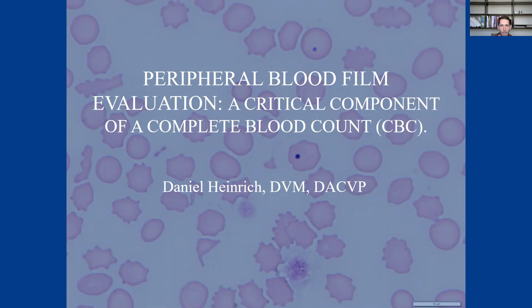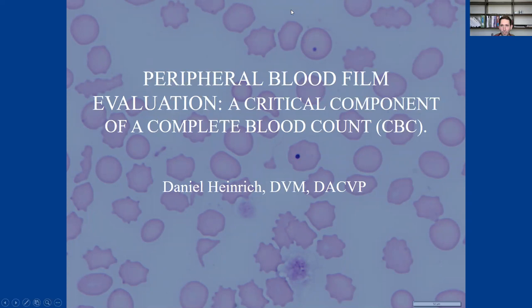Today I wanted to go over peripheral blood film evaluation with you guys and go over some case examples of why this is so important and an often overlooked part of our CBC or our complete blood count. I'm not going to keep this camera on the whole time just because I find it distracting, so I'm going to hide myself, but hopefully you guys will still be able to hear me just fine.